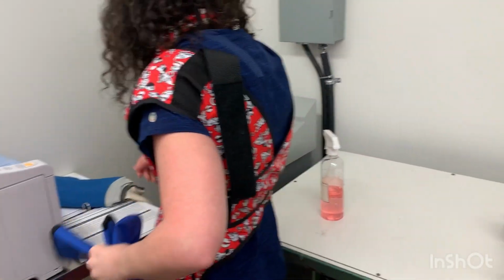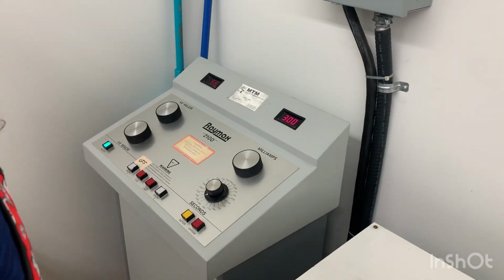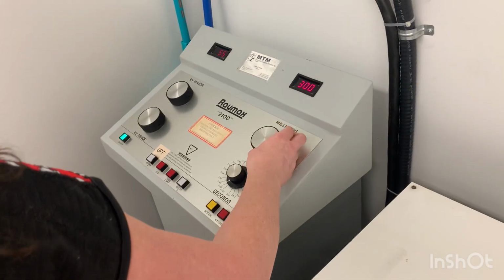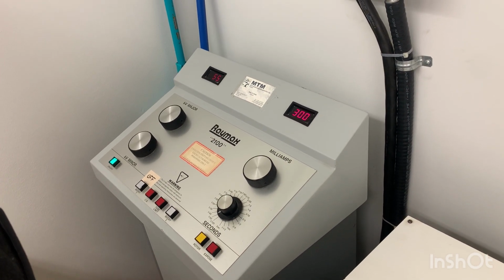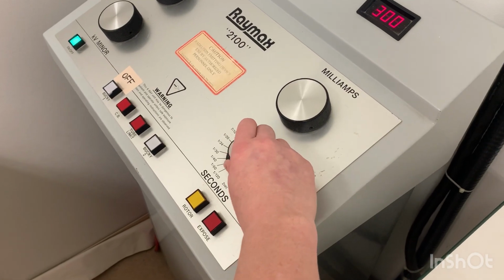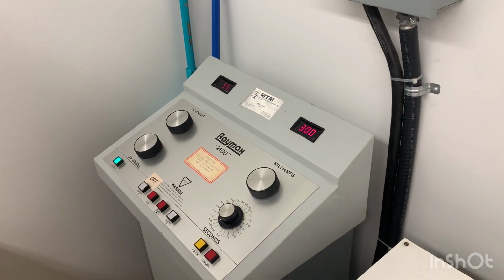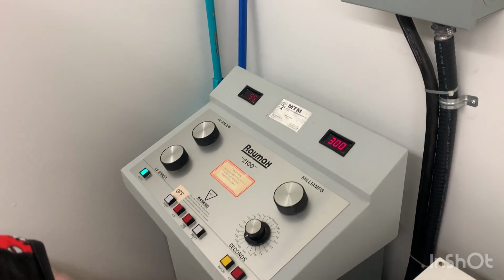Okay, so now I need to turn this on, and I'll have to adjust my settings. As you can see here, the abdomen needs to go into 300 because of the size of the dog. My index says that, and then 160 if it's already on there, but to change it you can just go like this. And then we need to be doing the KVP. So the KVP is going to be at 68.